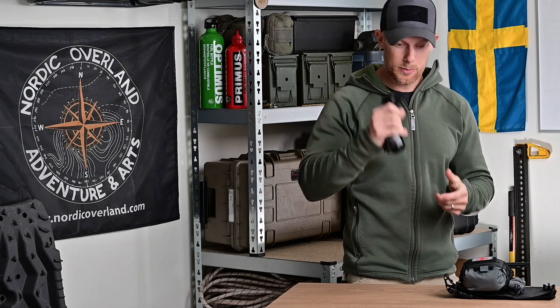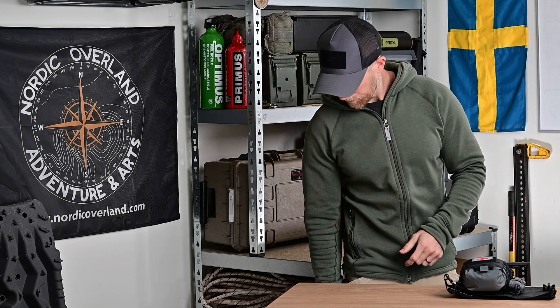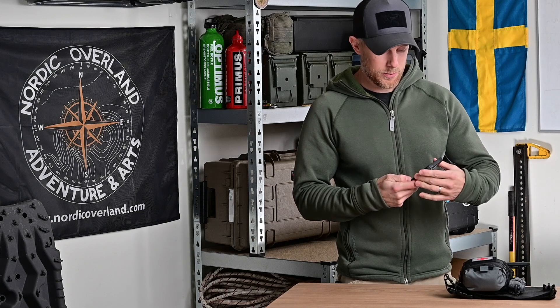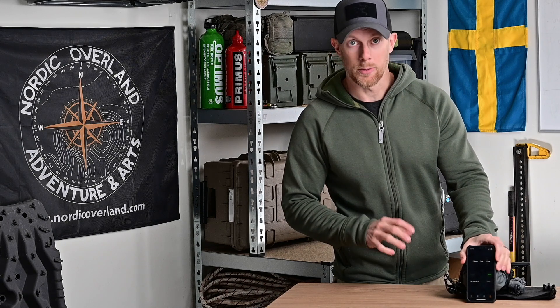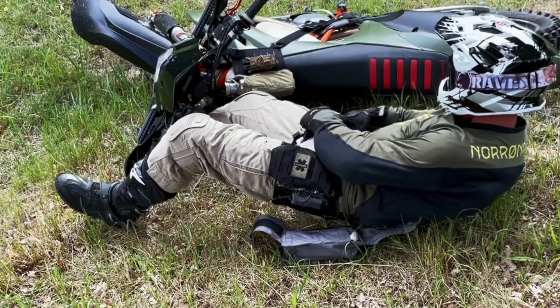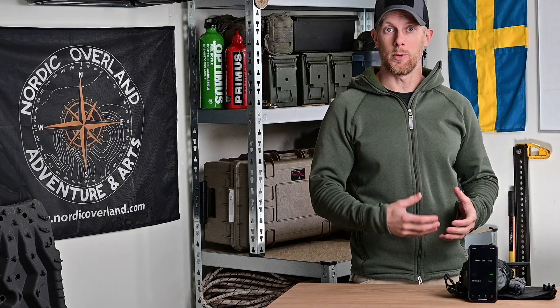Nu startar vi testet. Jag placerar tonikén i benfickan med cardboard-locket och stänger det. Jag har inga MC-byxor eller handskar på mig men gör ändå en rättvis förevisning och tar tiden. Vi sätter timern på 45 sekunder – den syns i bild så jag inte fuskar i videoredigeringen. Scenariot är att jag har kört och vält och drabbats av en artärblödning. Den enda stressfaktorn är tidtagningen. Jag rekommenderar att man övar så här med sin toniké.